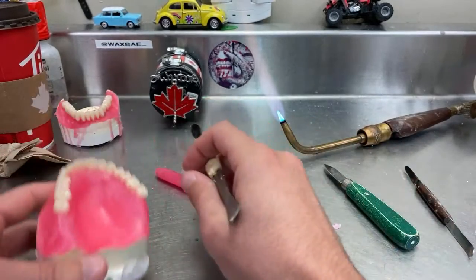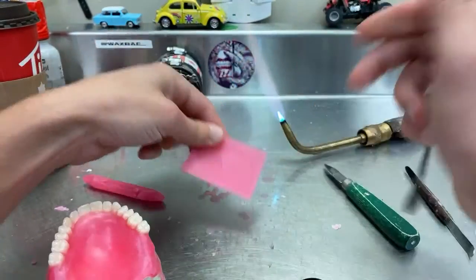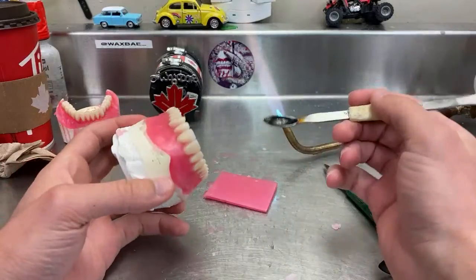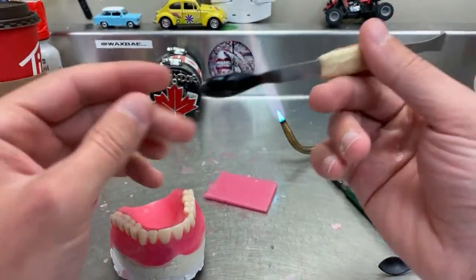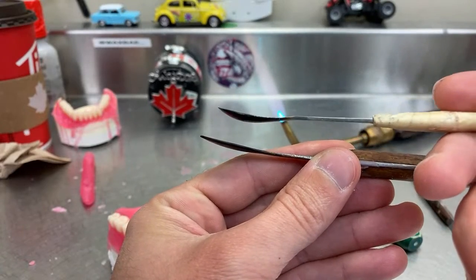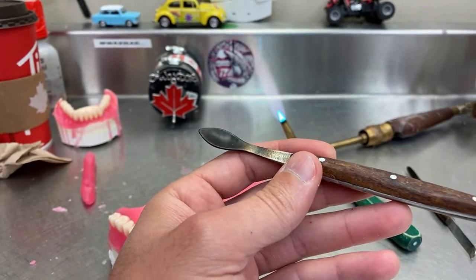By, let's say, I have something like this here, and then like that, and I'll show you how it's done this way and the other way, and you be the judge if you want to use this. This is like a scoop. It's deeper than this. You see how this is flat? This is deeper. This carries more wax, but there is a downside to that. So I'll show you.